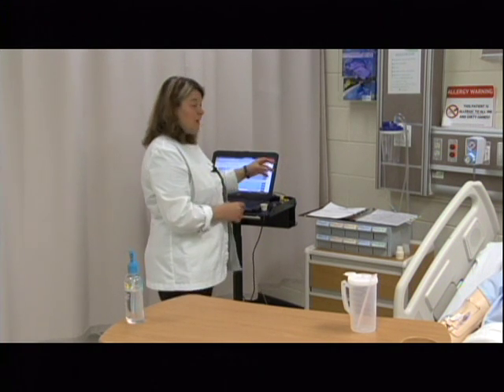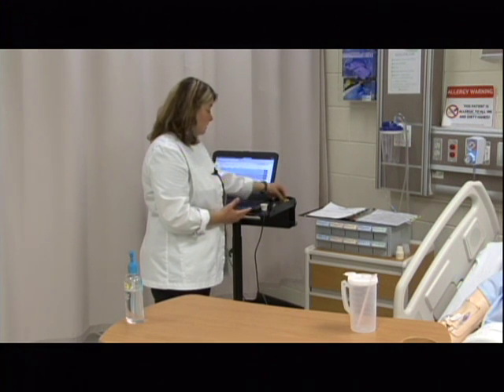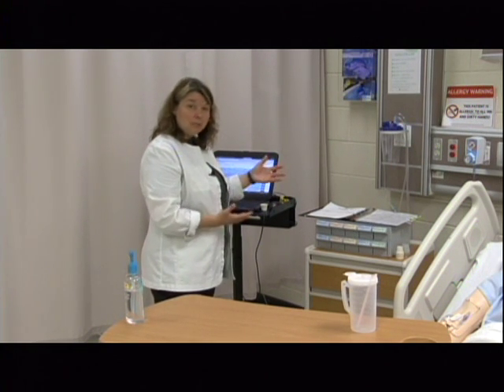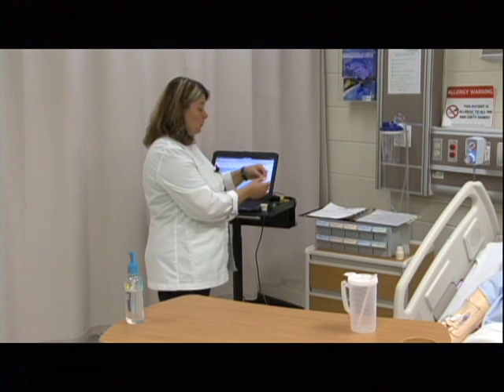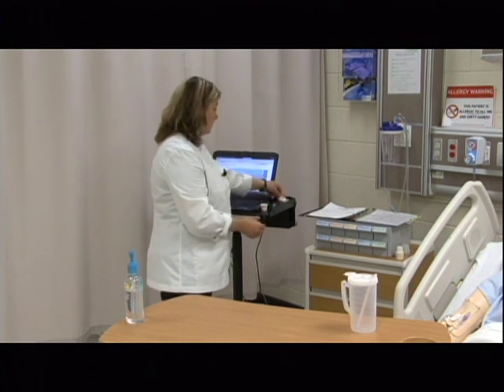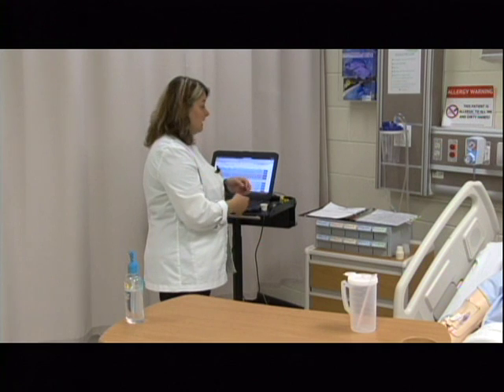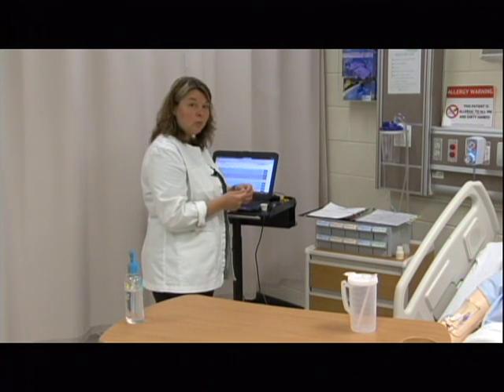If I ended up having to draw out any medication from whatever the original package was, then I would need to make sure that I labeled it. I'm not going to have to do that with these medicines because they're already in a pre-package, they're already labeled, everything is good. But let's say if I was giving like an IM injection and I needed to draw the medicine out of a vial. Anytime I take something out of its original package, it must be labeled at that point.